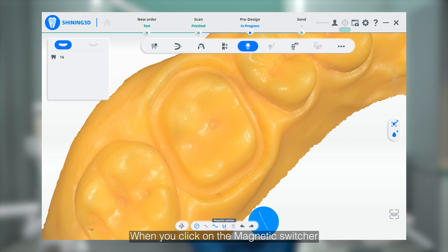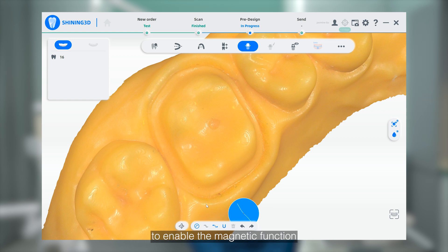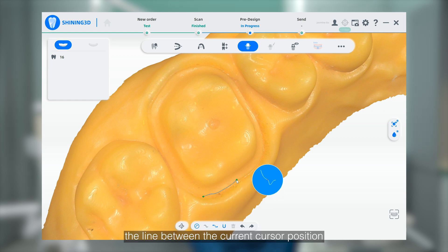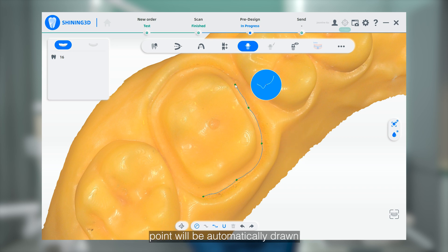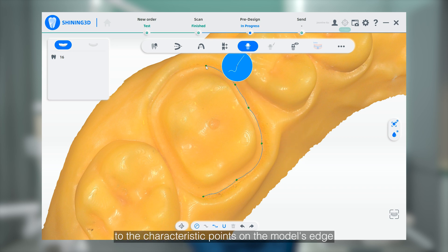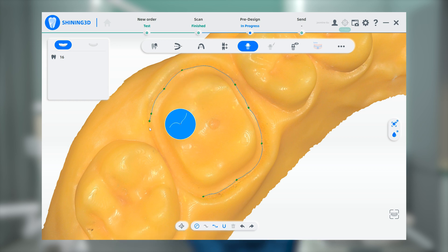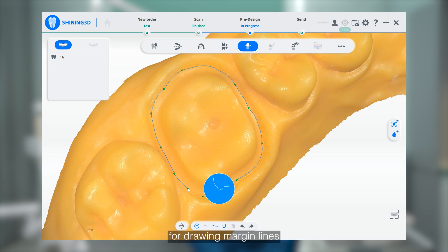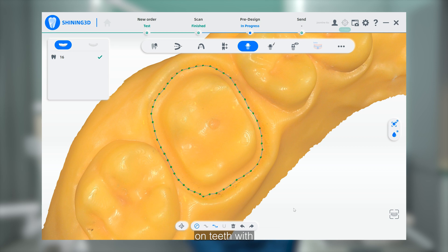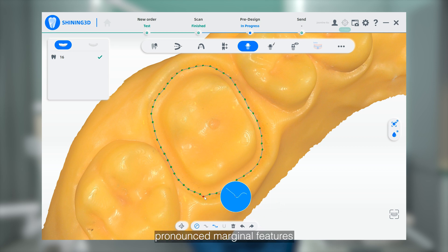When you click on the Magnet switcher to enable the Magnet function, the line between the current cursor position and the previous control point will be automatically drawn to the characteristic points on the model's edge. This makes it more suitable for drawing Marginal lines on teeth with pronounced Marginal features.